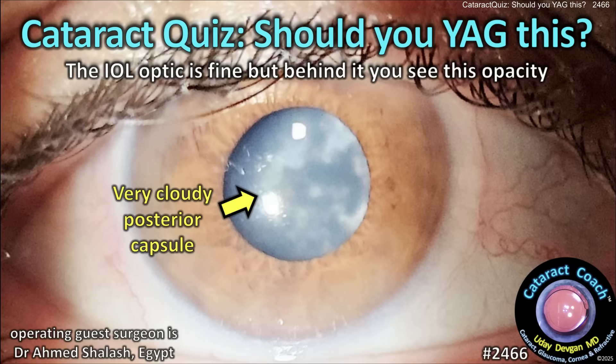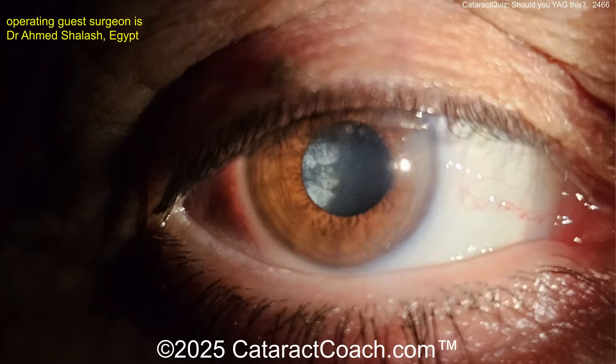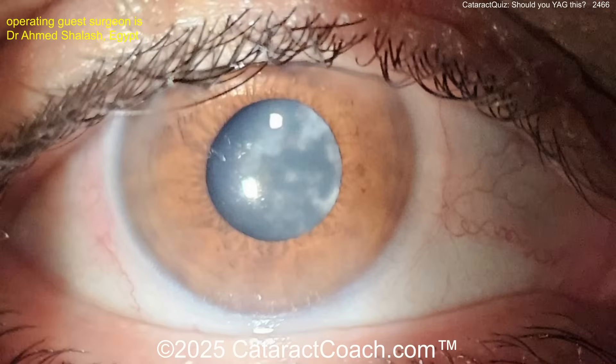CataractCoach.com cataract quiz: should you YAG this? The IOL optic is fine, but behind it you can see all this opacity. The patient had cataract surgery a year or two or three ago, and there's a lot of posterior capsule opacification blocking the vision. Do you do a YAG laser capsulotomy here? And then what happens — does all that material float around in the vitreous?